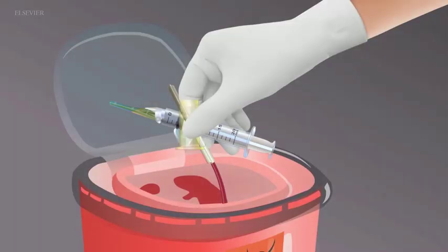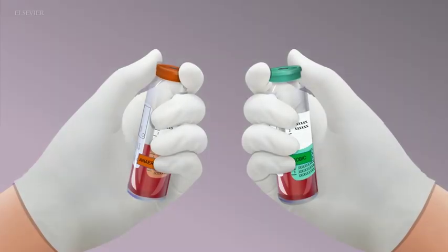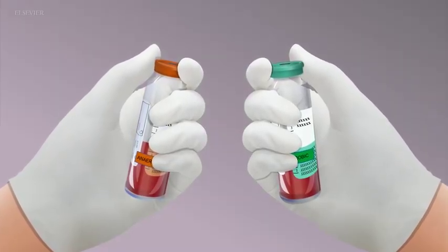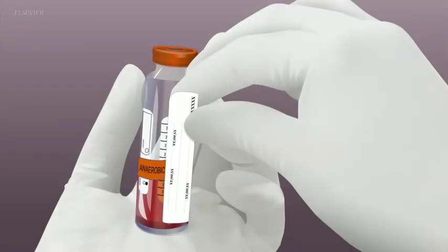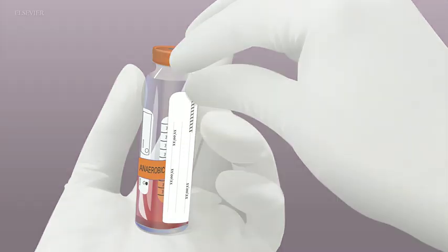Immediately discard the remaining sharp devices, including the collection barrel and transfer device, into an easily accessible sharps container. Gently mix the culture broth and blood in the bottles. Examine the culture bottles for signs of external contamination with blood. Decontaminate the bottles if necessary per the laboratory's practice. In the presence of the patient, label the specimens per the organization's practice.